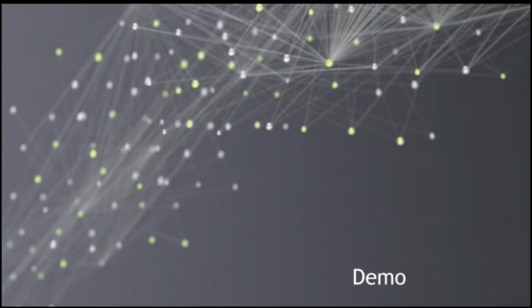But yeah, I know a neurosurgeon. He uses CT to measure ischemia or hemorrhage, and they train a MONAI Label model and share the trained model with the Slicer community, but not the data set. So it is possible to do.